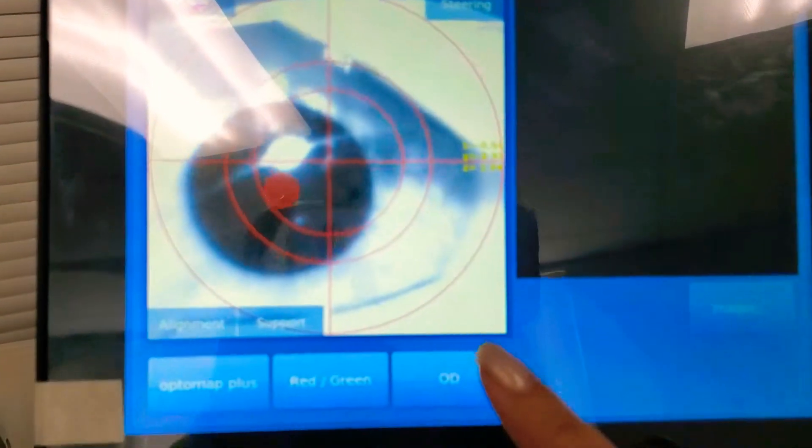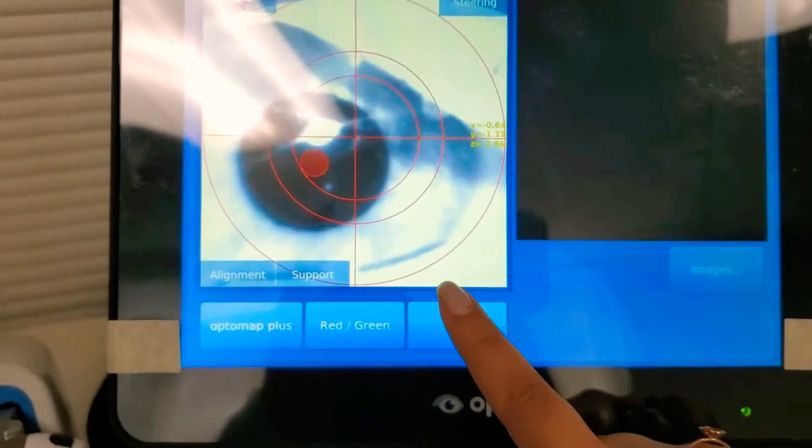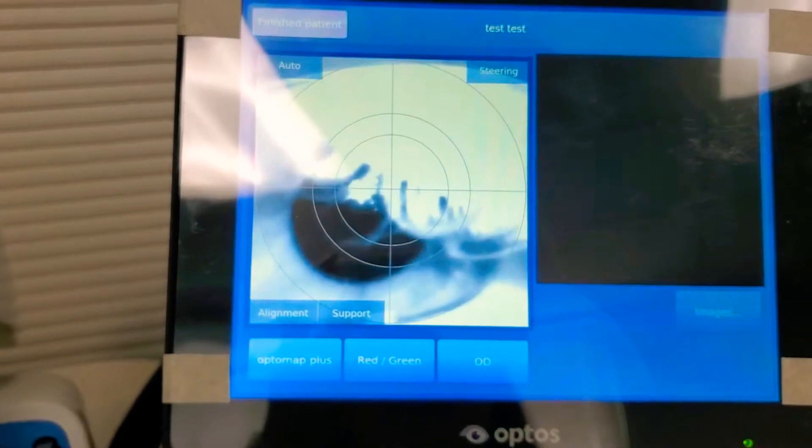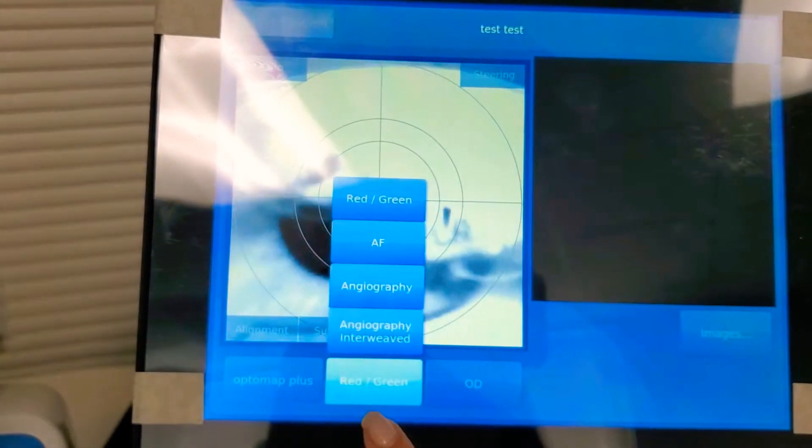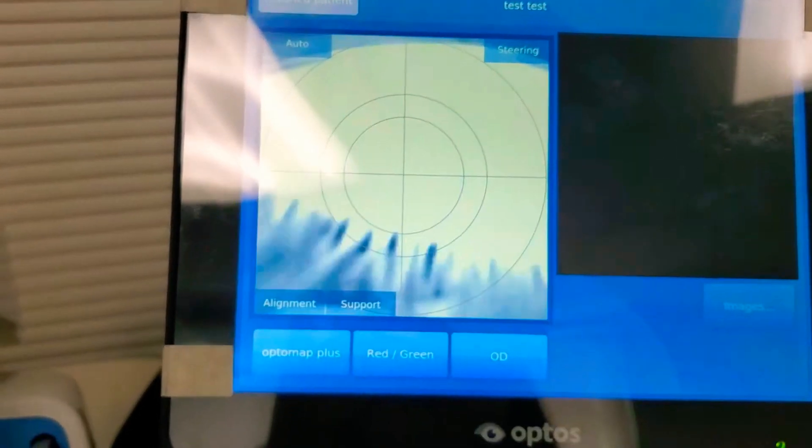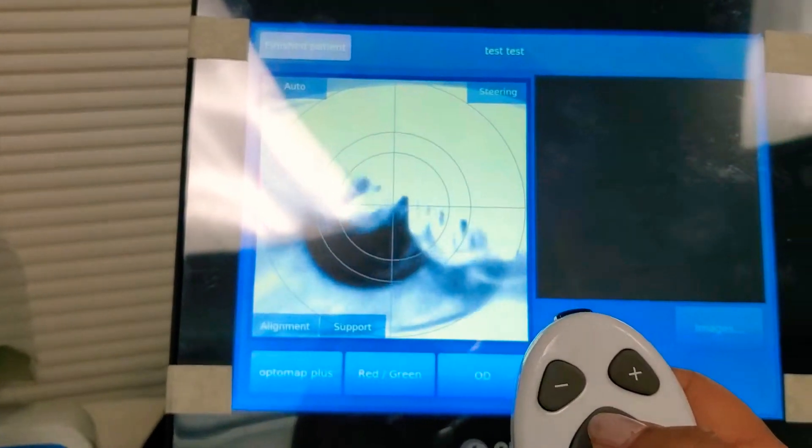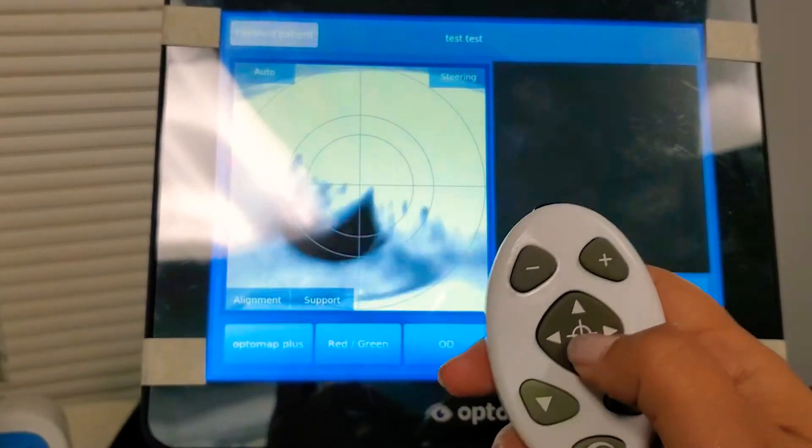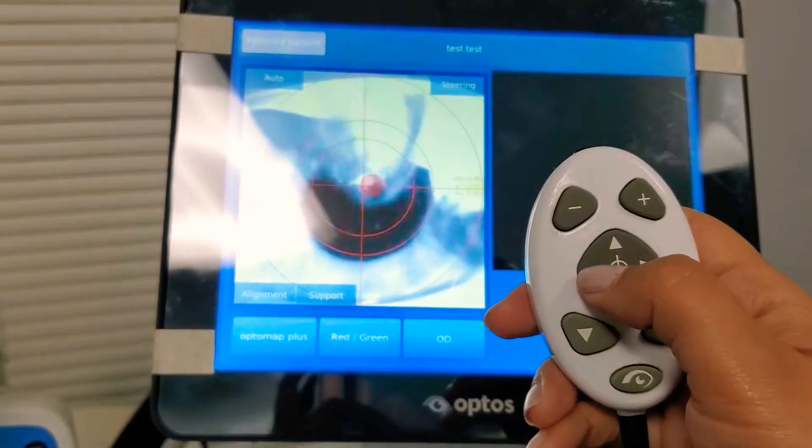And you can click this button to choose which eye, OS or OD. Right now, we're taking the general colored pictures, which is red, green. And from here, we'll use the joystick to move the patient around. So we go ahead.